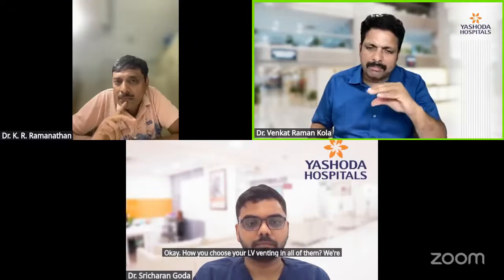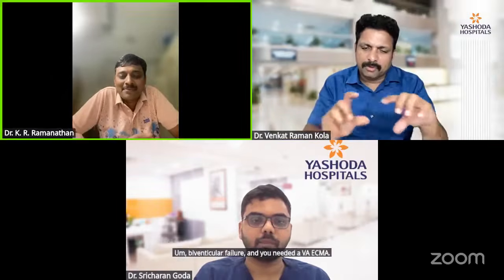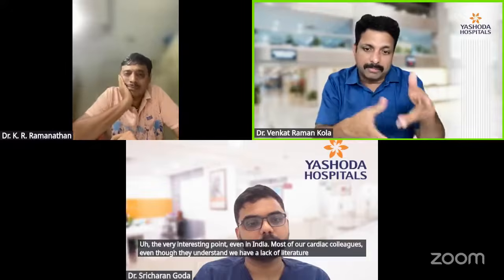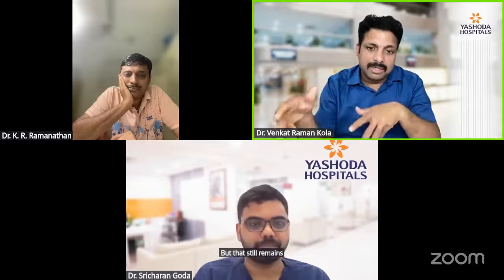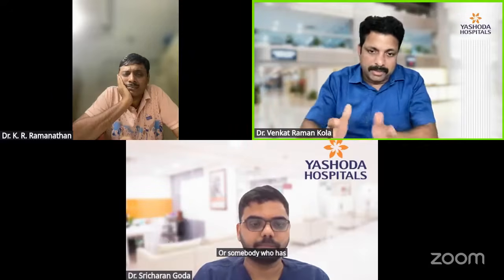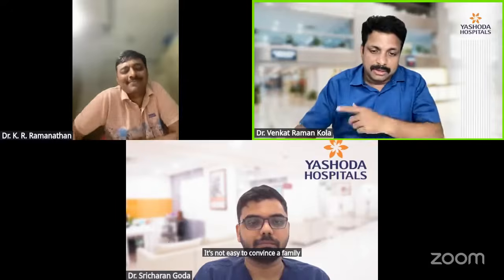How do you choose your LV venting in all of them? We're talking about non-myocardial infarction, biventricular failure, and you needed a VA ECMO. Impella is clear in a myocardial infarction setup, but for the rest, how will you choose? Yeah, very interesting point. Even in India, most of our cardiac colleagues, even though they understand we have a lack of literature evidence supporting IABP's role, it still remains one of the earlier modalities to support. And if it fails, or somebody has been preemptively ready for an Impella, they go. Otherwise, it's not easy to convince a family on the table to switch to an Impella.